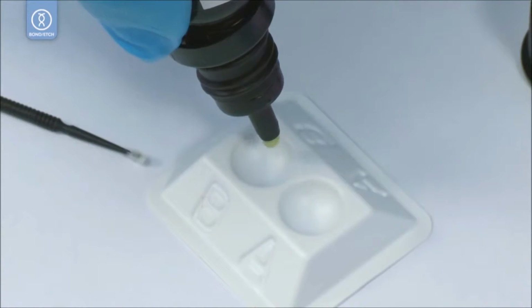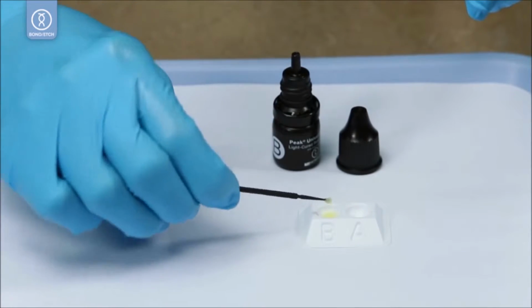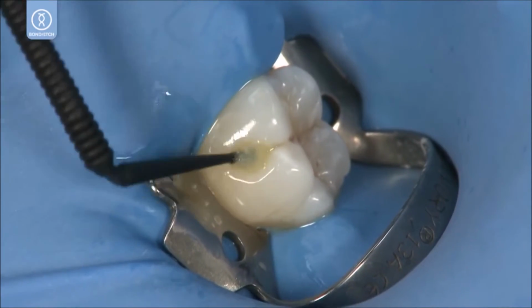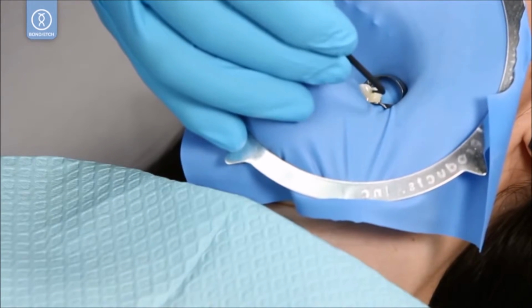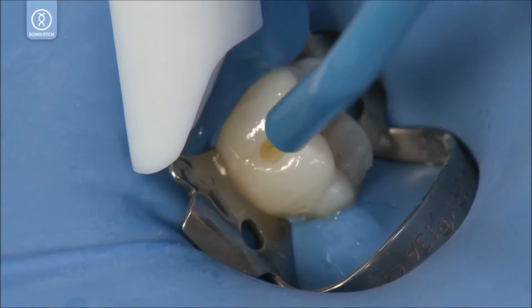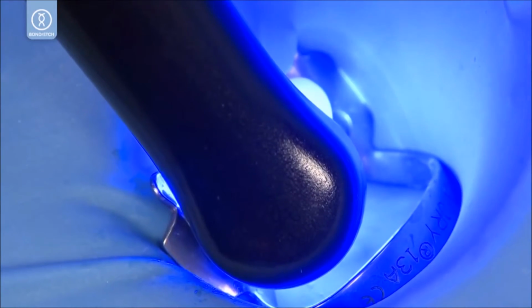Place 1 to 2 drops of Peak Universal Bond into well and load the micro applicator brush. Apply Peak Universal Bond and gently scrub dentin for 10 seconds. Thin and dry at half air pressure for 10 seconds. Light cure with Valo for 10 seconds.